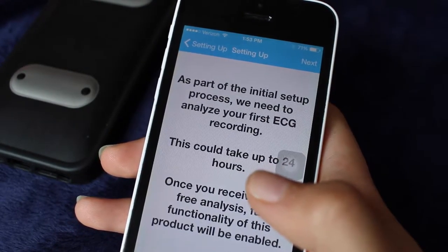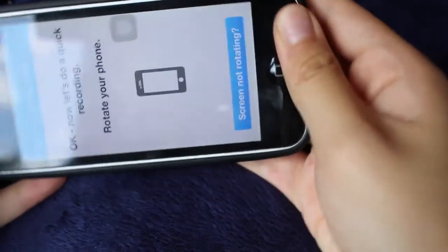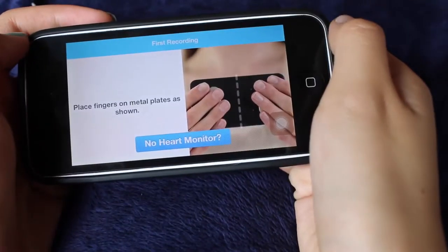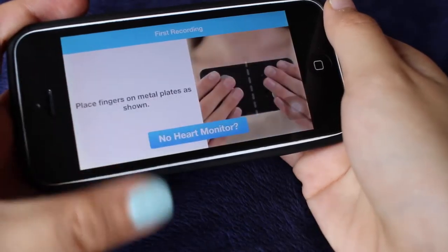To get started, place your phone in the heart monitor case and rest your arms on a flat surface. Then place your fingers on the metal plates as shown on the screen.